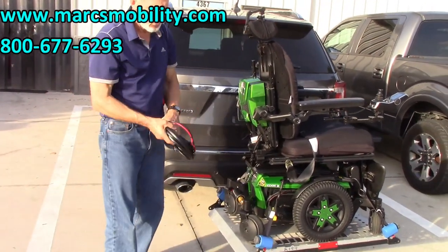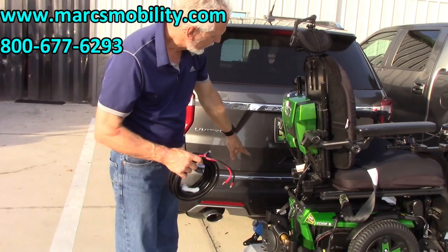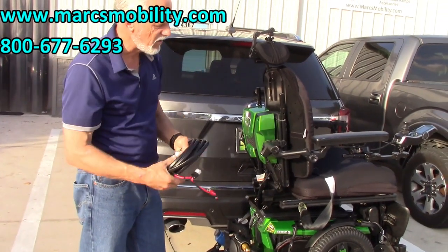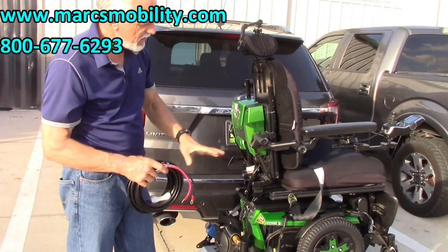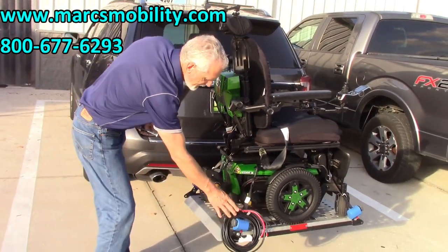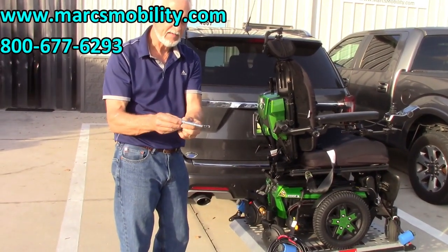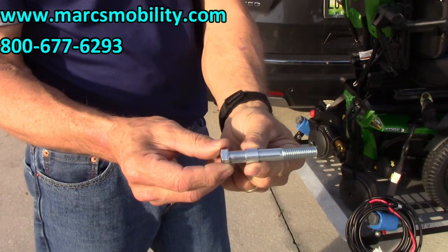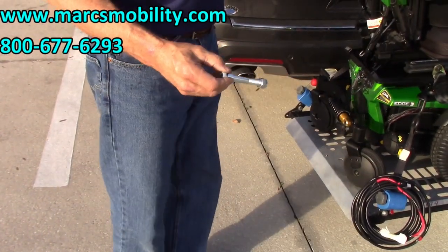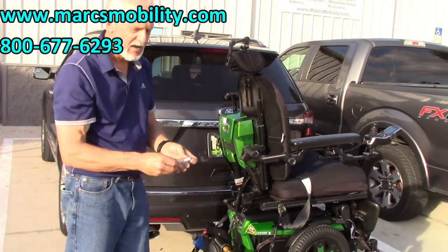We send a heavy-duty cable with this lift. You have to connect that cable directly to your battery — do not go to your trailer plugs or tail lights. Go directly to the battery for more power to the lift, because you'll need all the power you can get to lift this near-400-pound chair. We'll also send you a pin with a sleeve. That sleeve goes on the end of the pin and inside your hitch, taking all the wobble out so there's no play in the lift when going down the road.